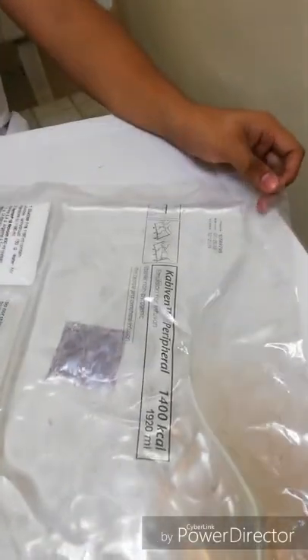Today I will be showing you how to mix the total parenteral nutrition, or TPN, one of which is Cabiven.